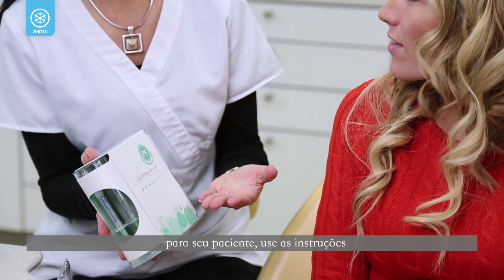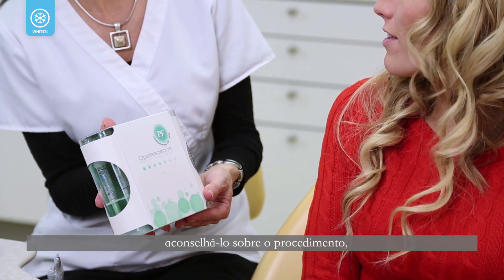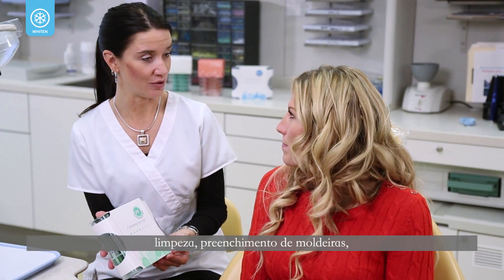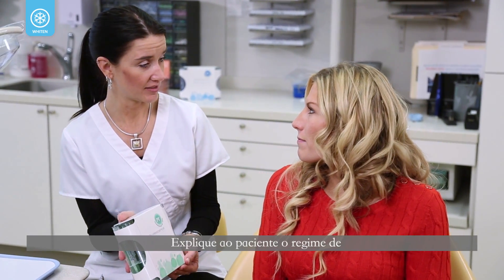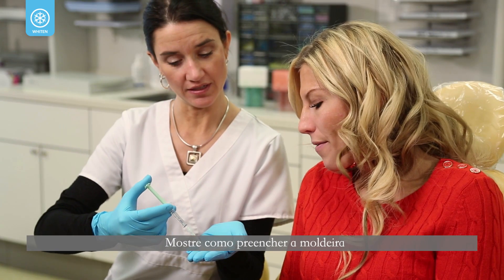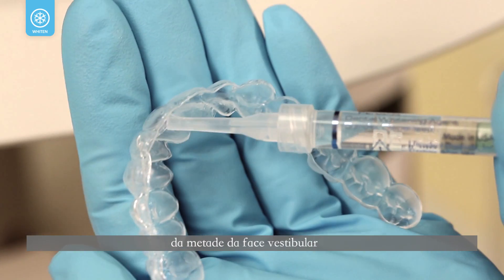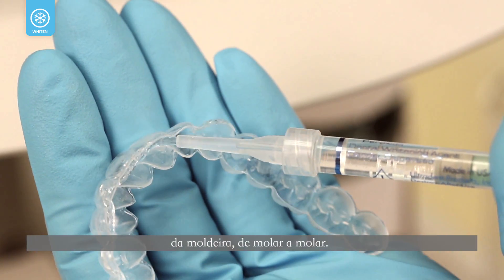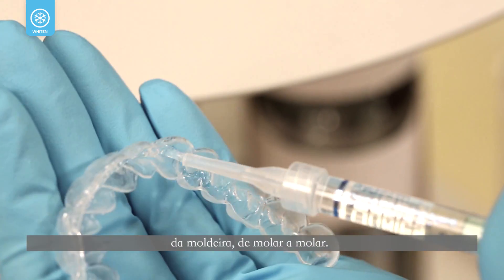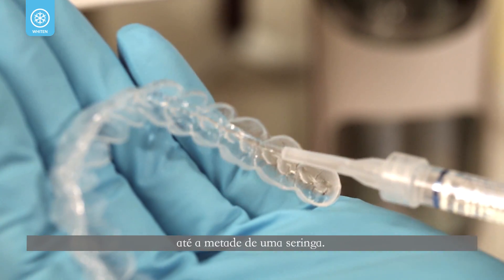Once you have prepared the trays for your patient, use the provided patient instructions to advise the patient on the bleaching procedure, tray cleaning, tray loading, application of Opalescence, and tray care. Explain the recommended treatment regimen to the patient. Show them how to load the tray by expressing one continuous bead of gel approximately halfway up from the incisal edge on the facial side of the tray from molar to molar.